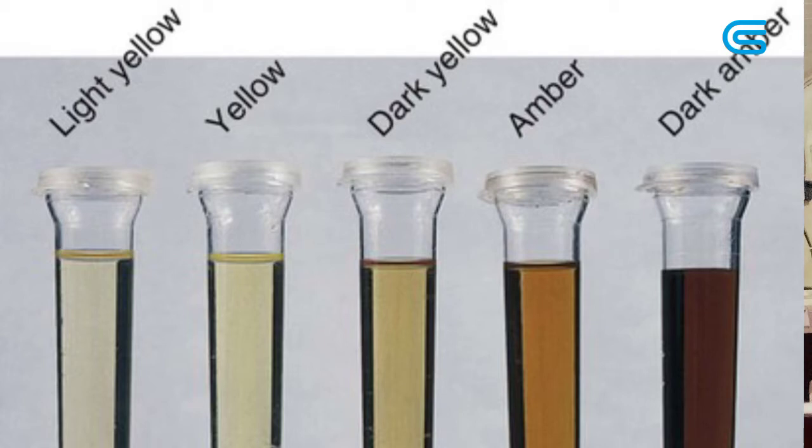So the appearance is just the transparency. How much can you see through the urine? Freshly voided urine specimen is normally clear and transparent.